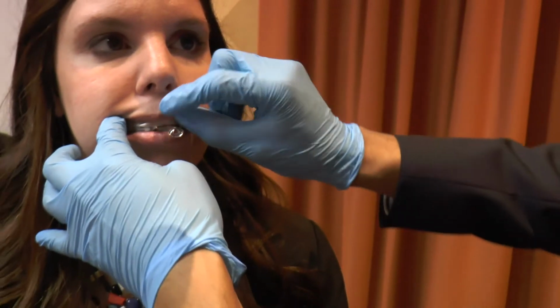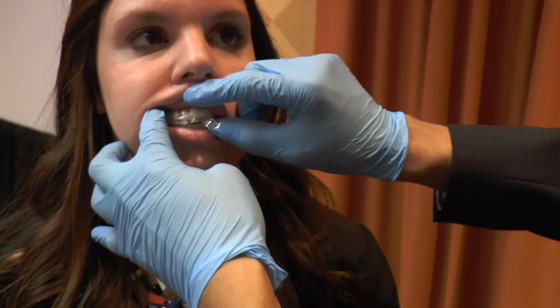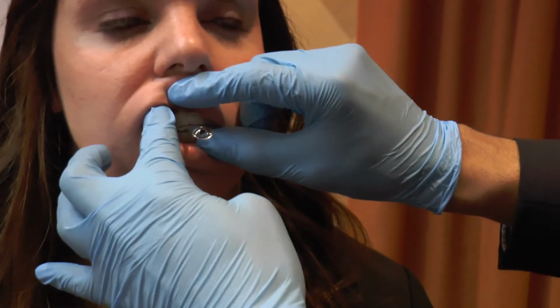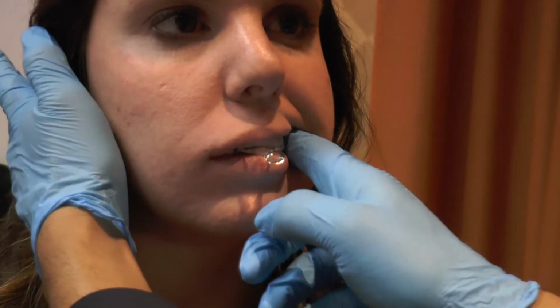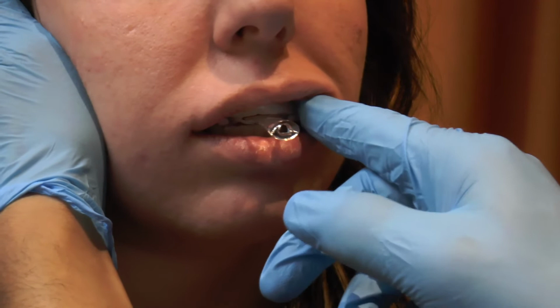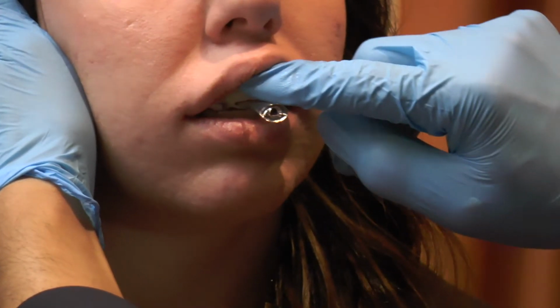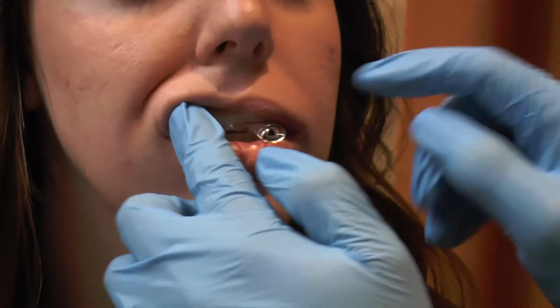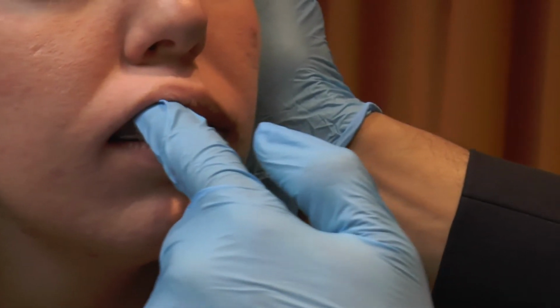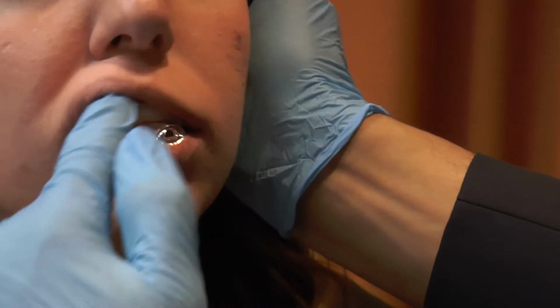So what I'm just going to do here is walk up along the buccal wall, just bite into that, and I'm just going to push up against it so it adapts to the teeth, allowing better retention. If after adapting it and you've allowed the tray to cool, you find you have poor retention, then just place it back in warm water and remold it. The advantage with this material, it returns to its original shape, so you can remold it multiple times without having to use a new device.